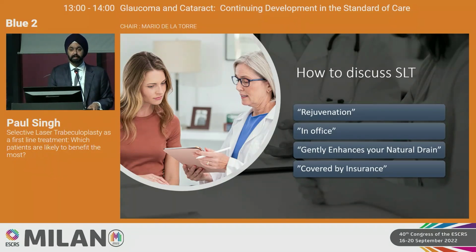So I tell patients, Mrs. Smith, I'm going to use a beam of light that's going to rejuvenate the natural drain. It's going to use your natural enzymes to excite your tissues to open up those pores naturally. In the US, it's covered by insurance. It just takes a few minutes to do, and you get to go home without any kind of barriers to post-op recovery as well. So these are the key phrases. Now, if they say, is it a laser?